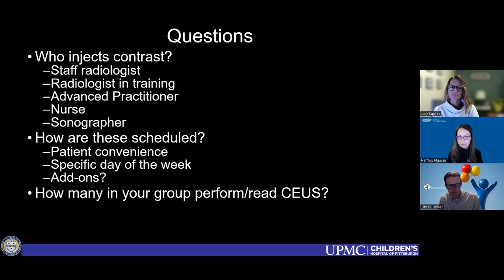As far as who is actually doing these examinations, when we first started, we had just a few sonographers and a few radiologists that were quote unquote approved to do these examinations. And it was really a challenge from a scheduling perspective. The schedulers had to look up which sonographers were working, where they were working, and which radiologists.